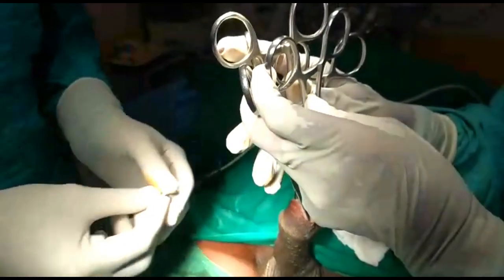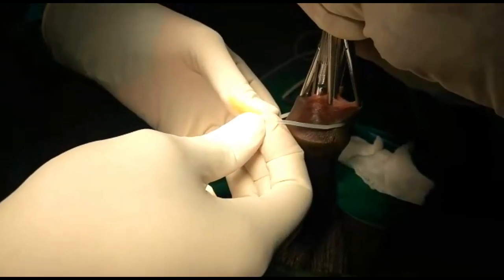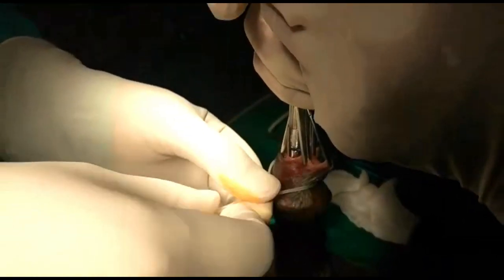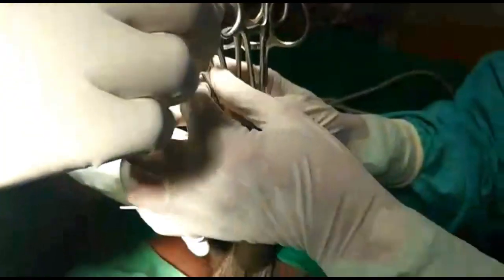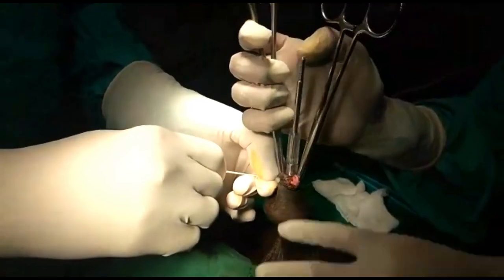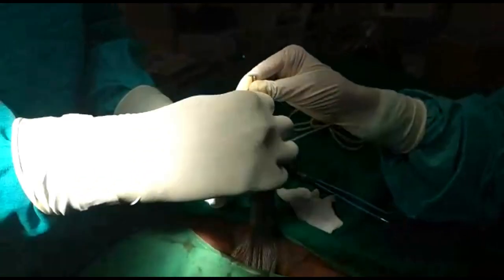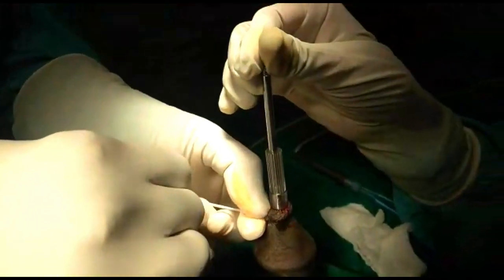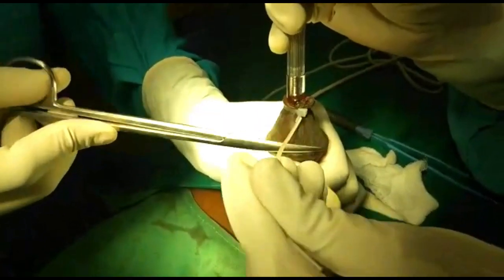What I am going to do is take a loop and tie it round like that. Just release the artery forceps one by one. So I am going to release the artery forceps. This is all tightened up here, and I am going to cut off this excess thread.